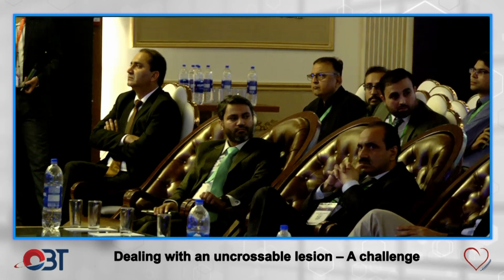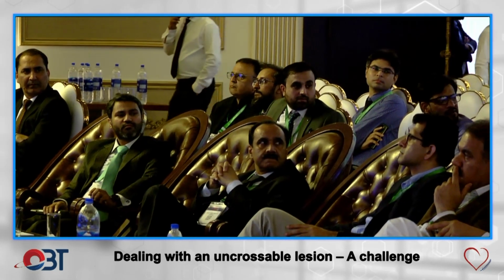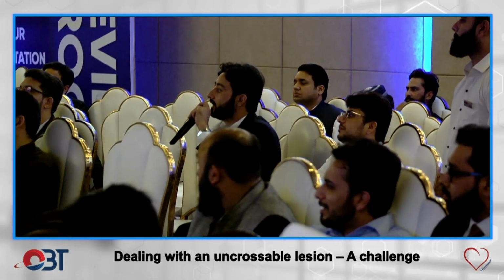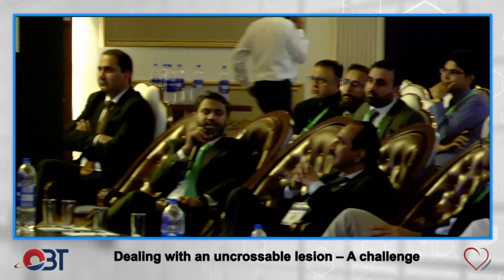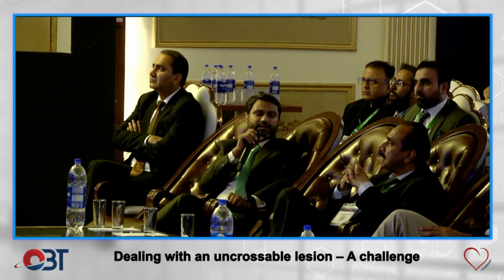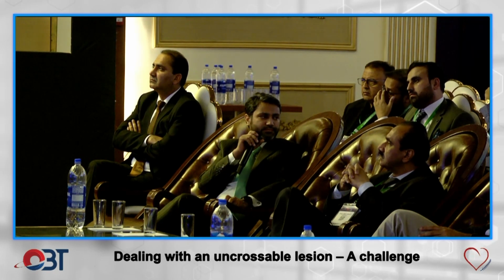Sir, excellent case. My question is that your microcatheter was not crossing. Did you try an AL guide because it is more supportive? It could have been tried. Ultimately we took an XBRCA. The rotational atherectomy was done with the XBRCA, extra backup. That was the best guide available for extra support.